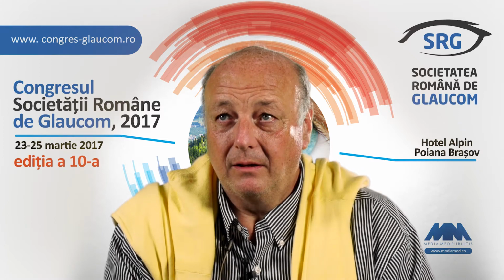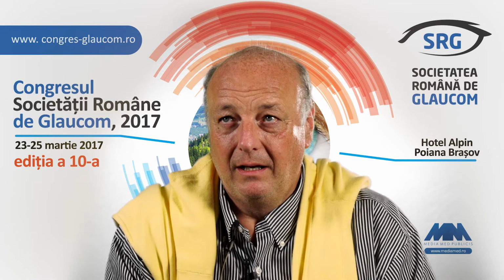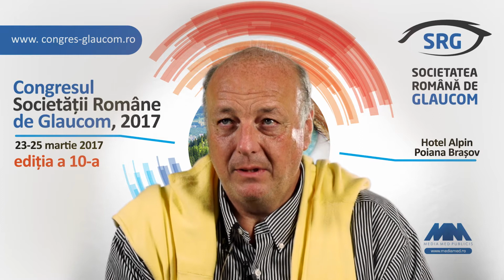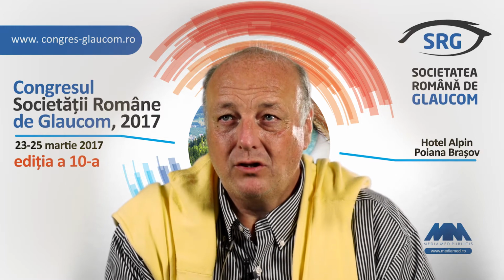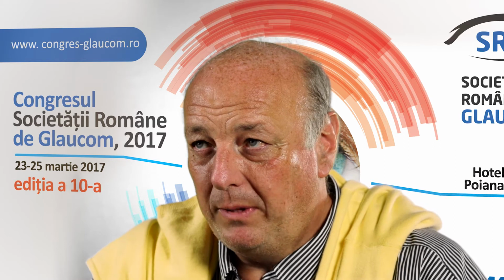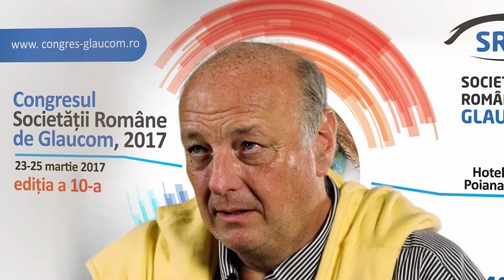You need it not only once in the life of a glaucoma patient, but depending on the stage and the rate of progression, you should perform this examination between 1 and 4 times a year, depending really on the individual patient. You need it for ocular hypertensives as well as glaucoma patients. You should repeat it all with the same machine.